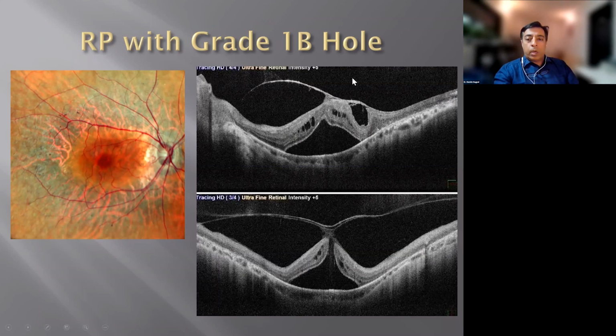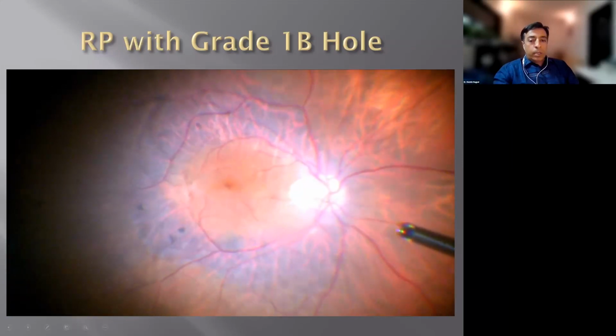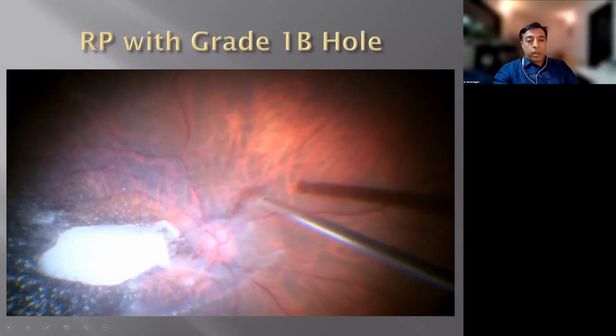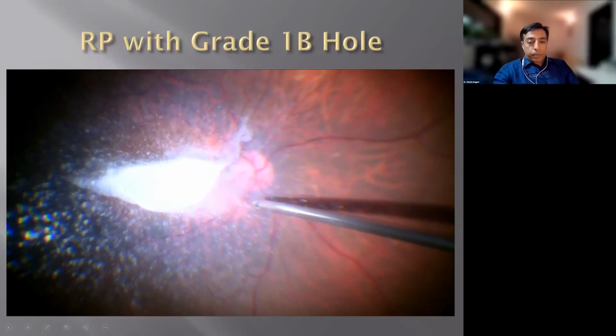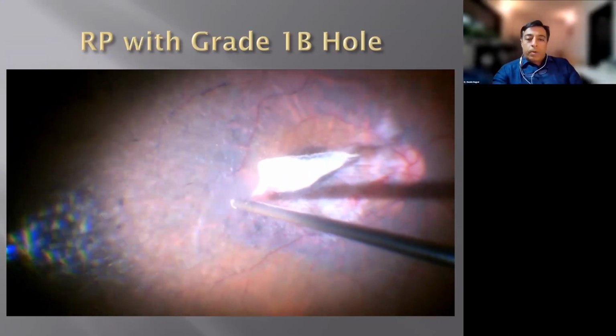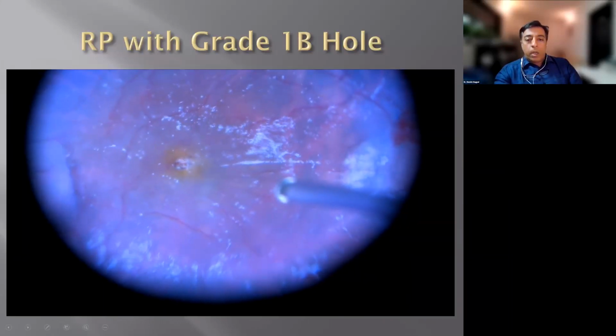Now, this is a case with vitreomacular traction with early hole in a case of retinitis pigmentosa, and in these cases, sometimes there's adherent vitreous and membranes which come up. So, in this case, I wanted to show you a peculiar phenomenon that happened, but initially, of course, we are doing the PVD creation. We have stained the hyaloid and are gradually clearing up the residual area.